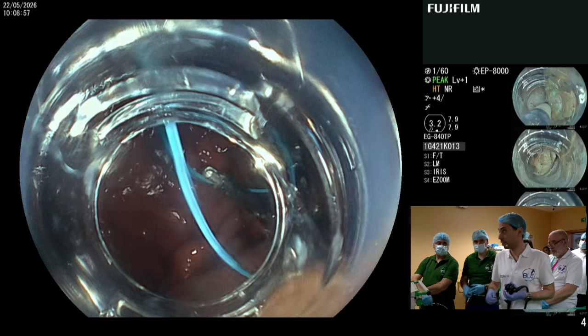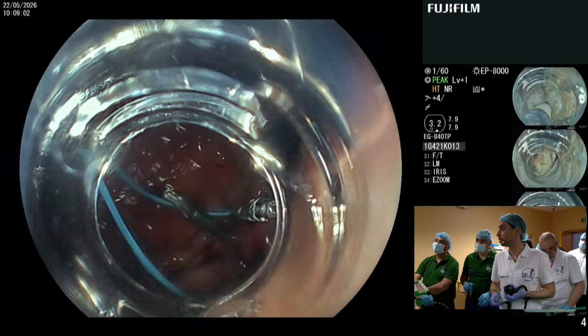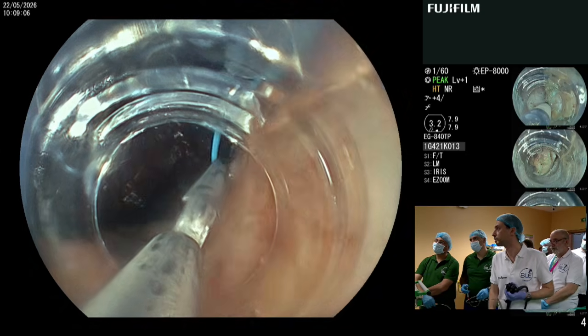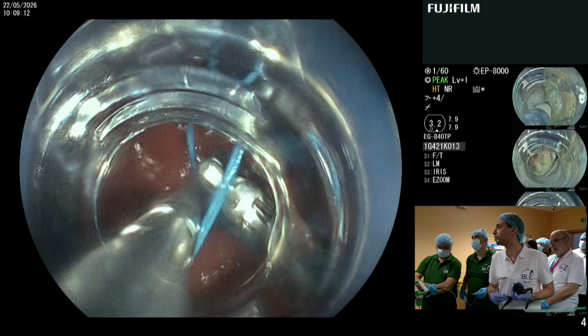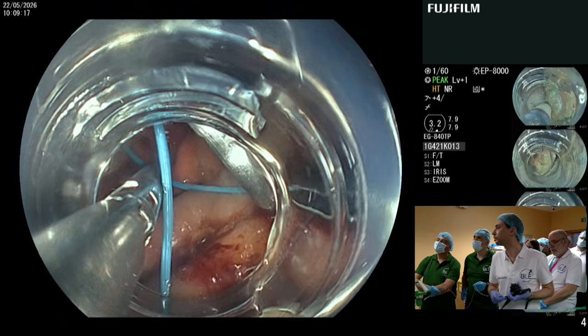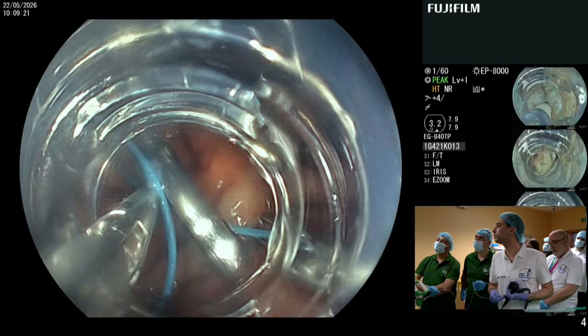I understand that this is an expensive closure, but this is the best way. Open. All right. Let's. All right. So, yes. It's good there? What do you think? I don't see very well.